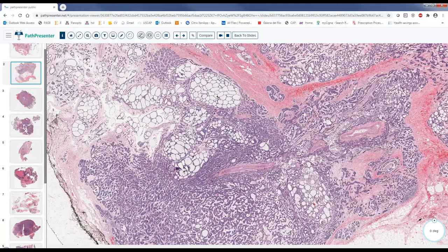Okay. The important thing is to describe the tumor: margins, perineural invasion, extension, the grade of the tumor, and be sure that you describe the margins and the grading as best you can.